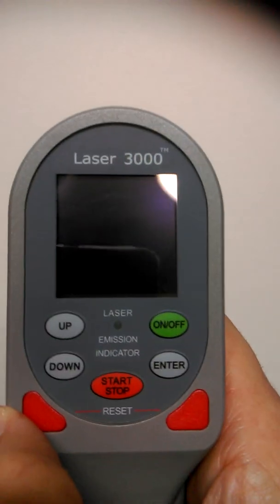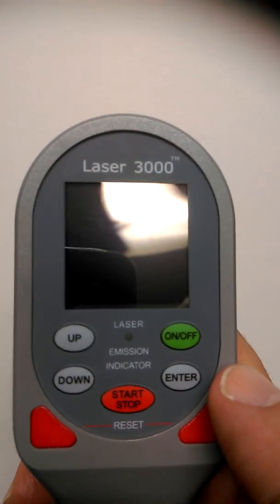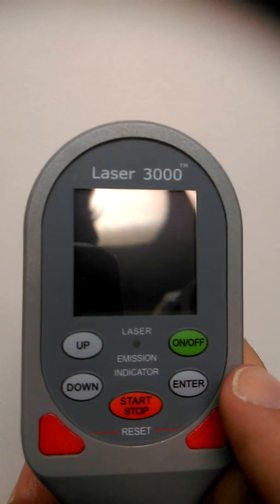Welcome back. I'm going to take you through the operational procedures for the Laser 3300. When we take a look at the handle, we see there's a green on/off button, an enter button, an up/down button, and a start/stop button.